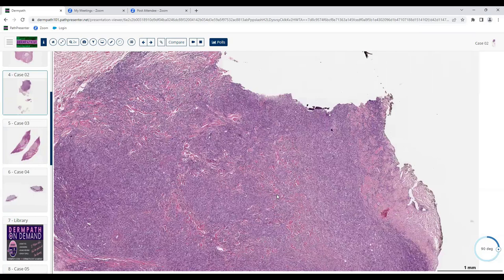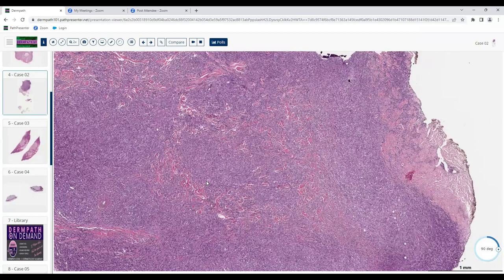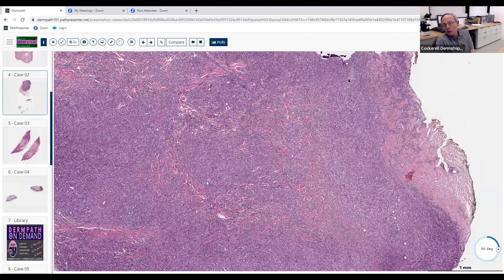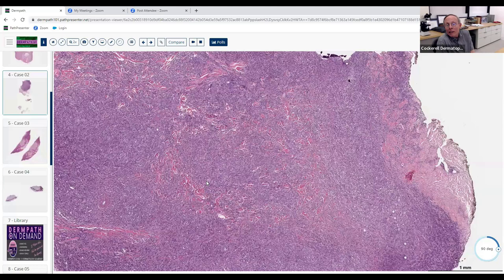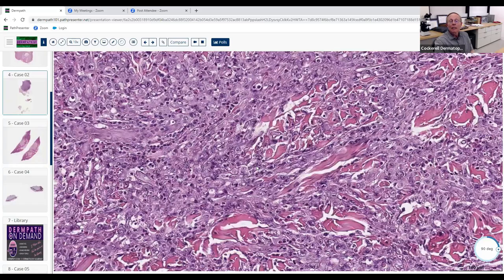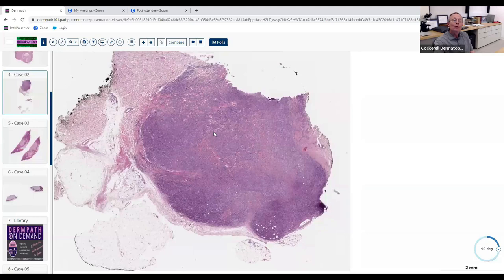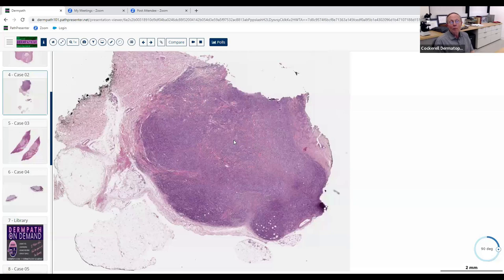You could do ALK — see if it's ALK-positive or negative. Good. We'd also have to determine whether this was primary cutaneous or metastatic from a systemic site. ALK positivity tends to be associated with the more aggressive systemic form. But many of these, when primary cutaneous, actually resolve on their own and don't harm the patient despite their very atypical cytomorphology — they used to be called regressing atypical histiocytosis.